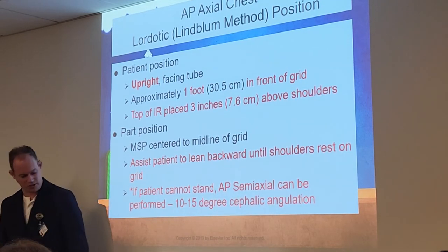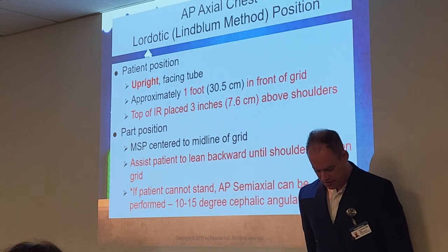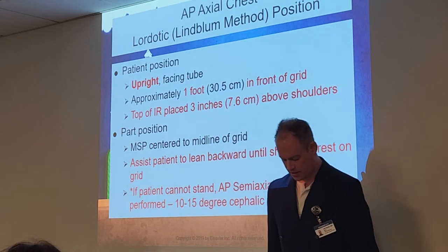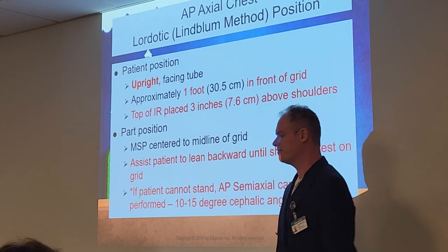And then, okay, let me show you so y'all can see. Against the IR, I'm gonna put this foot right at the tip of my left foot, and then the second foot to match. That's 1 foot. And then lean back.